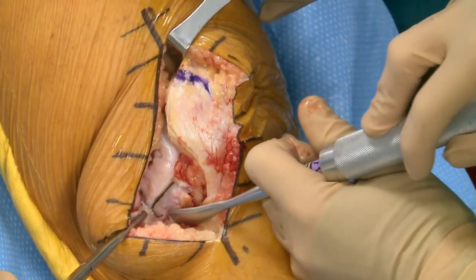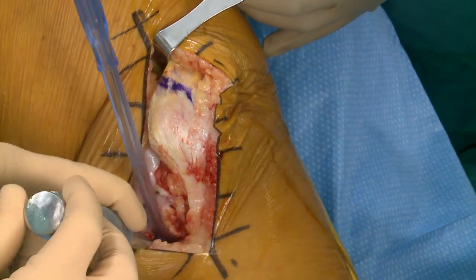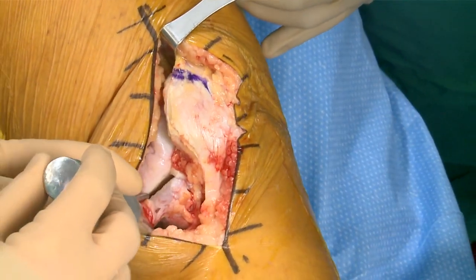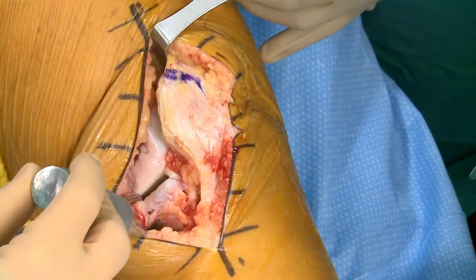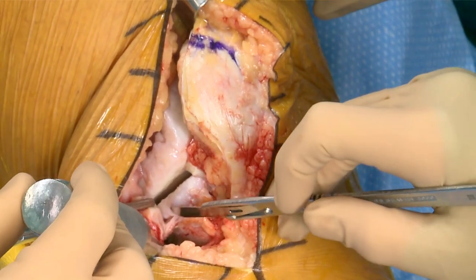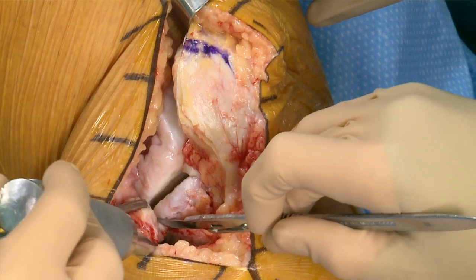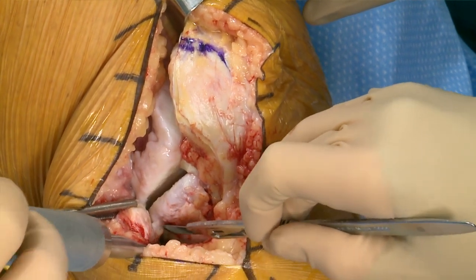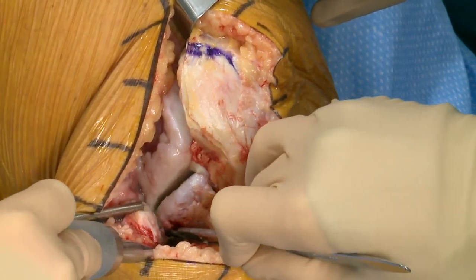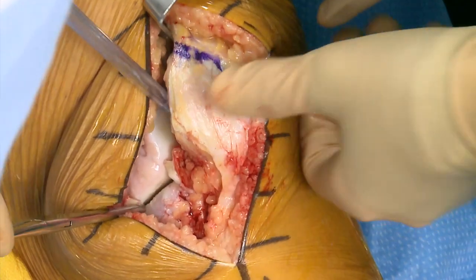We'll take a cob around the inside. We've got a view of the deep MCL as it's inserting just below that osteophyte. As far around as I can see — kind of mid-coronal — I'm going to peel it off the tibia so that it's in continuity with the superficial MCL going around, and I want to get about halfway around.